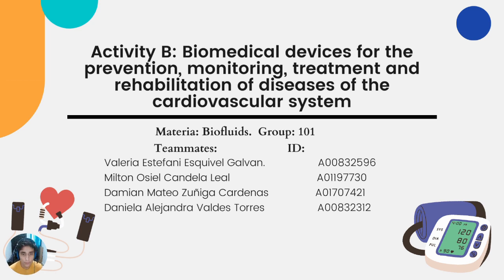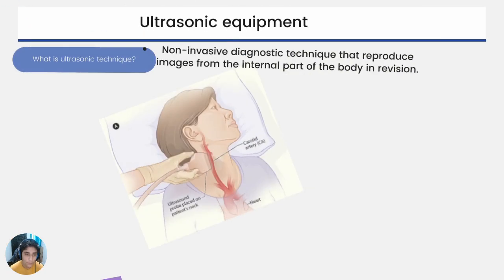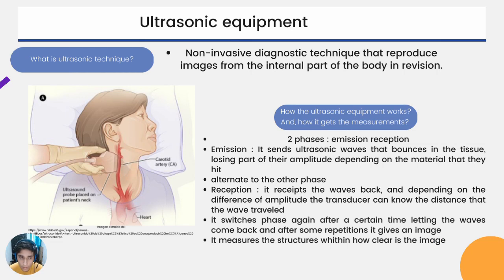We are going to talk about biomedical devices for the prevention, monitoring, treatment, and rehabilitation of diseases of the vascular system. So I'm going to talk about ultrasonic equipment. I'm going to talk about the parts of the ultrasonic equipment later, but first we're going to center on this.